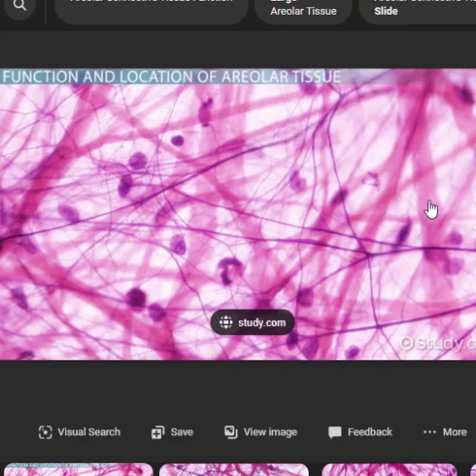So if you notice, there are some kind of thick fibers, like these thick fibers, and then there's some very fine purple fibers like this one. So these are collagen. The big thick ones are collagen, and the little thin ones are elastic fibers. So this is one of the things that allows our skin to be flexible.